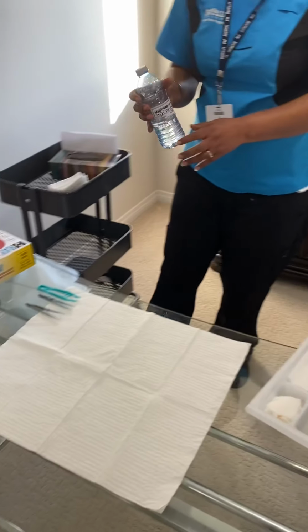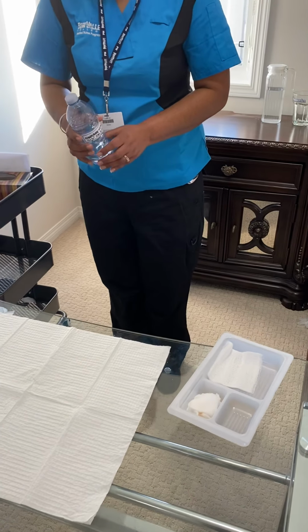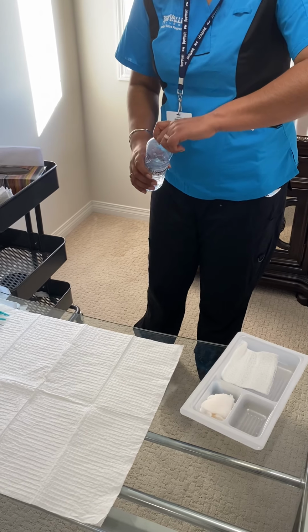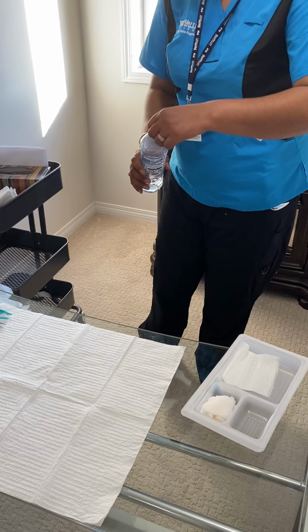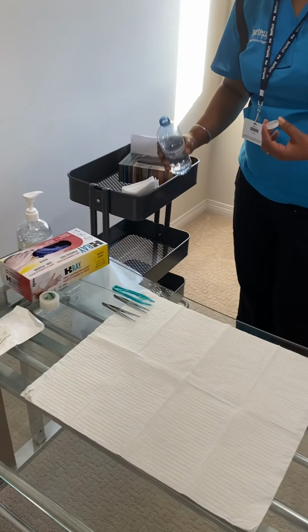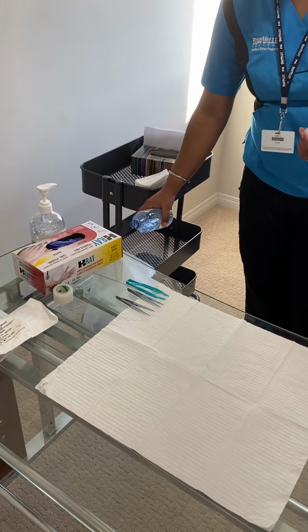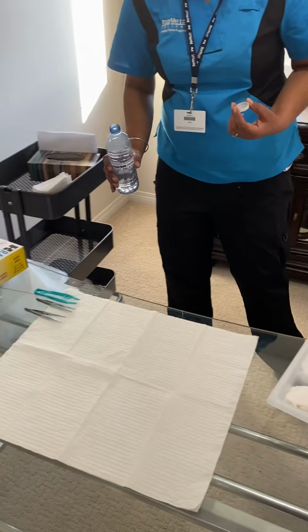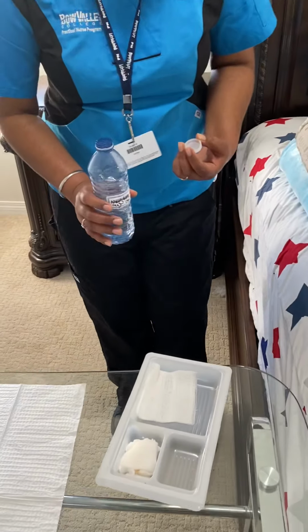So that as I check three times with the normal saline, I take off the lid and I pour off some of the normal saline in the garbage. And now I'm going to put it on the tray without touching.